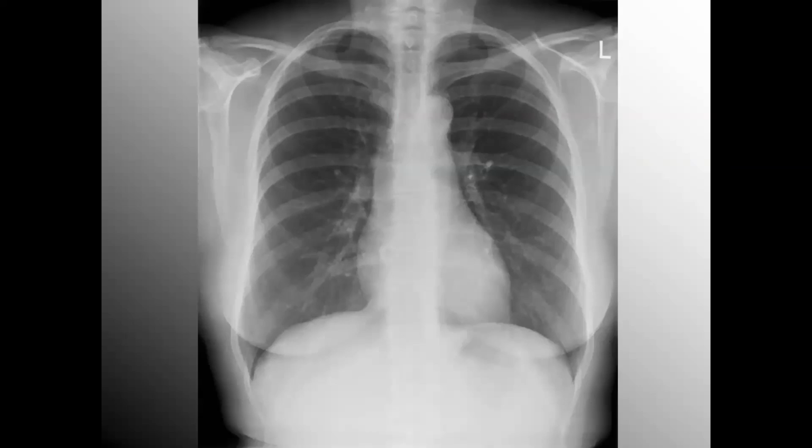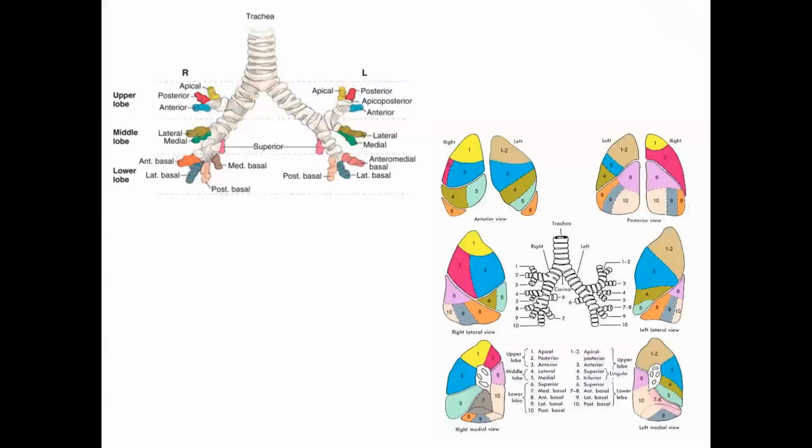With chest X-ray as well, similar to any diagnostic, it is of course helpful if you have perspective of the patient's baseline or at least a prior chest X-ray to compare it to, but oftentimes you just don't have that luxury, particularly in the emergency department or when the patient is in the clinic getting formally diagnosed for the first time. At that point, you must fall back on your appreciation of normal and what it should look like. And it does take practice.